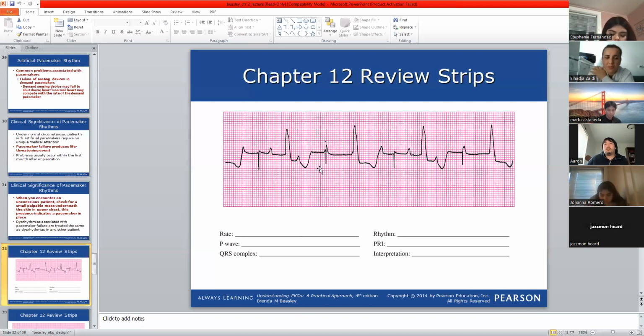You mentioned there is no relation between P and QRS. Okay, we mentioned that for any heart block, we look at whether the PR interval is prolonged and fixed. Here it is prolonged but not fixed. Of course, prolonged and progressive, no, it is not progressive. It gets bigger, then it gets small again, so it is not progressive.